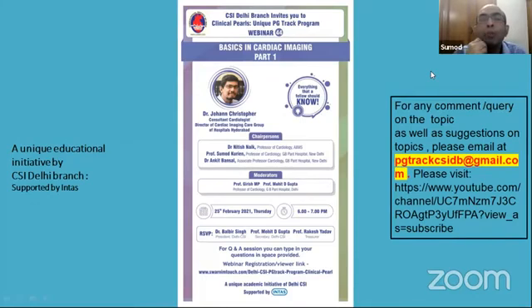Dr. Rohit from Bangalore wanted to ask, in hemochromatosis, what do we see in the T2 star image? Yeah, so we use the T2 star. It is a tool we use before gadolinium. That's very important when you're sitting with your tech: do not give gadolinium before you do the T2 star imaging. And the T2 star images have a low T2.